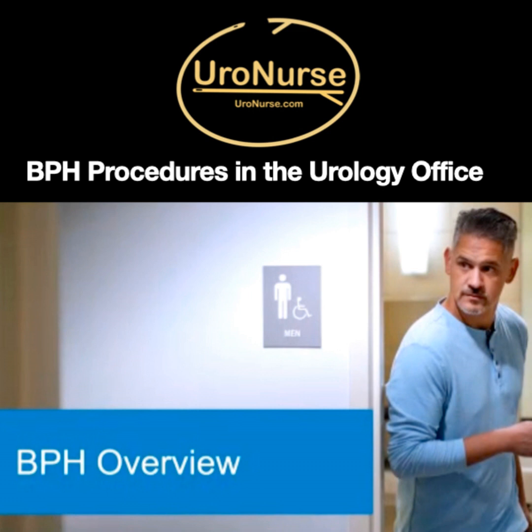Now, I have a handful of patients like this who desperately did not want to go to the operating room or couldn't handle a trip to the operating room, but they were in retention and they had a hypotonic bladder. I think it's a huge success for a patient like that to get them catheter free post Rezum, but still on sometimes even double dose tamsulosin and finasteride, because it's served its purpose. And so I don't think there's any reason to feel like that's necessarily a failure.